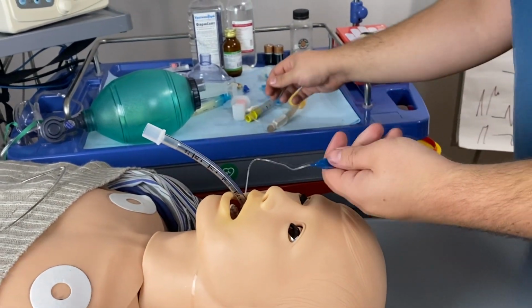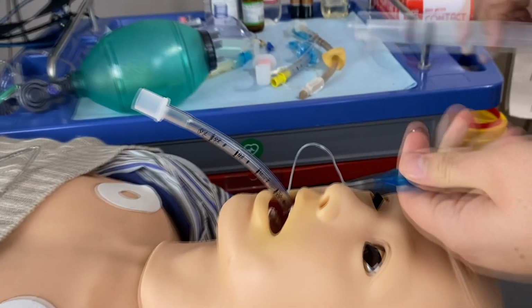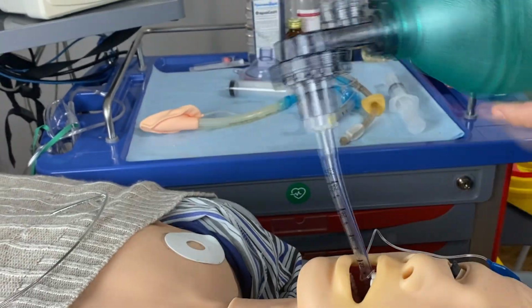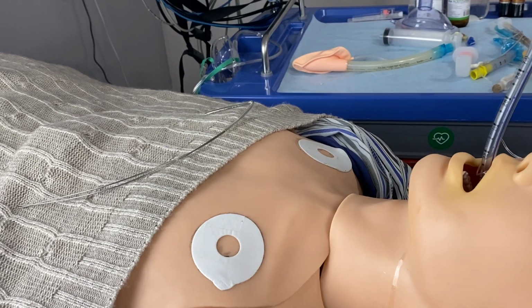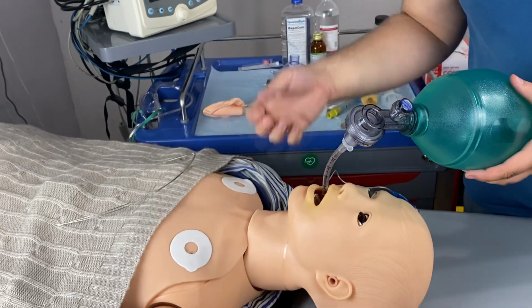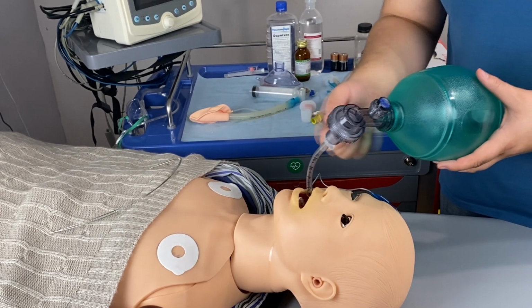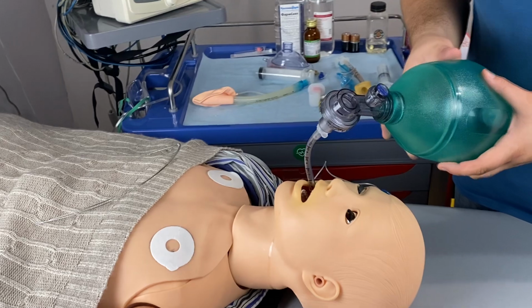So I am inside the trachea, then I take the syringe and I inflate the cuff, then I insert the bag and start ventilation. Now we see that the chest is rising, but we also have to check if we are correct in several ways. Basically, we use auscultation. We can also use capnography to see if it's air from the lungs but not from the stomach.